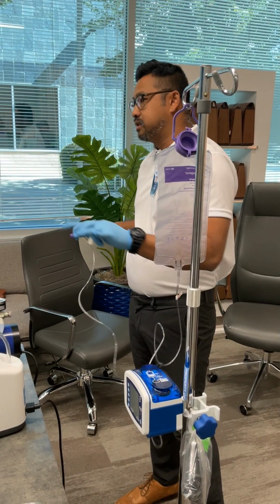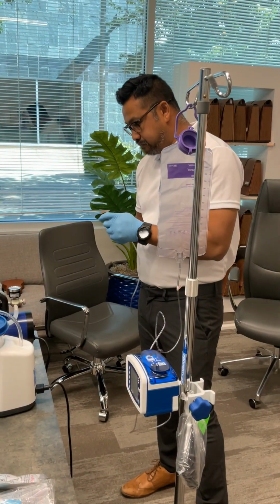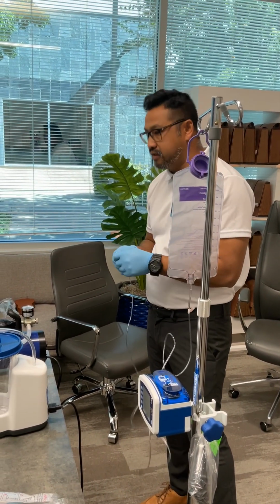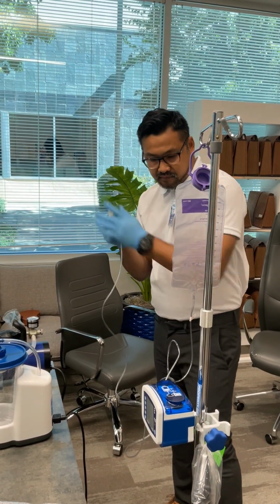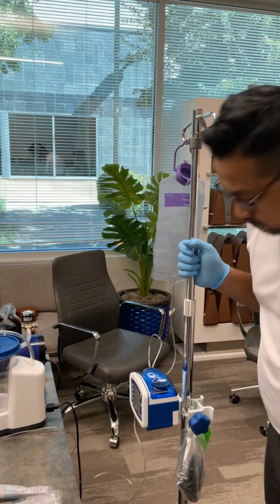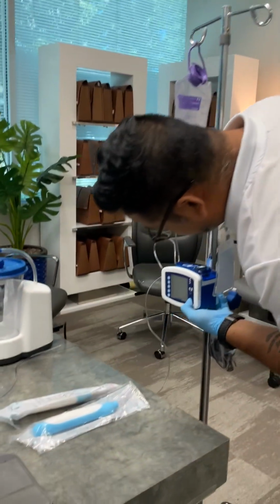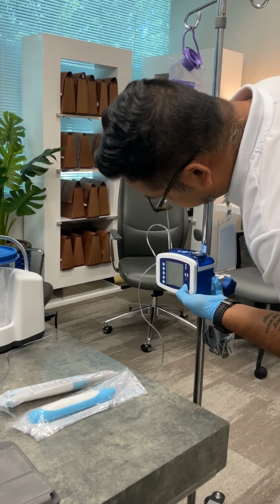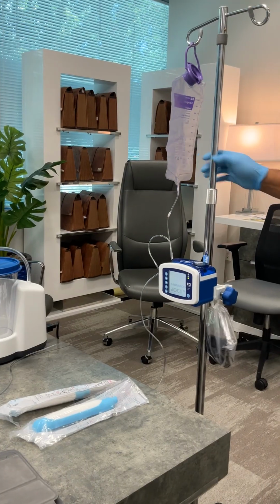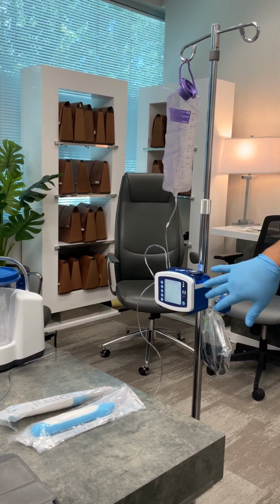So depending on the setup for the patient, it's different for every patient. Some people have it in the abdomen. Some people have it through an NG tube. It's dependent on the scenario. So let's just keep that covered. You attach that to the patient somehow. And then we have a power button. You press and hold that to start it. Might take a minute. It's going to show a little kangaroo hopping across, and then there's going to be some numbers on there.